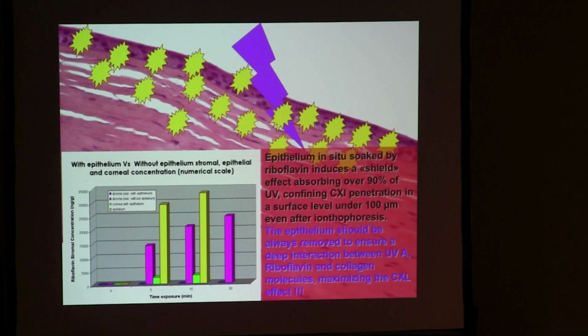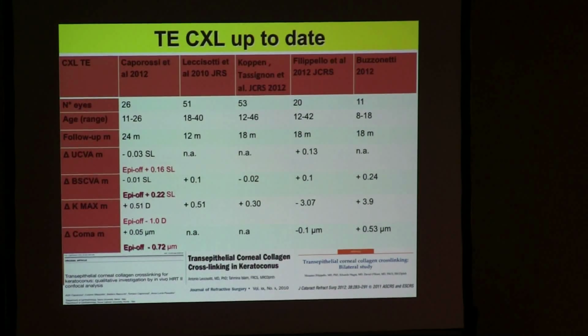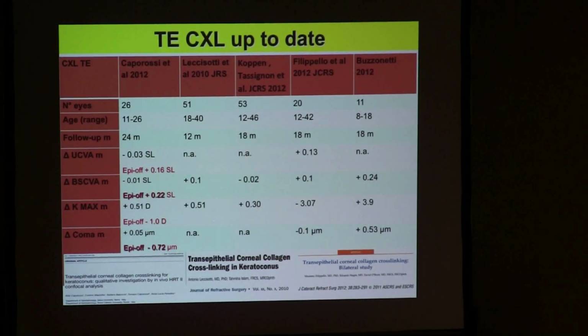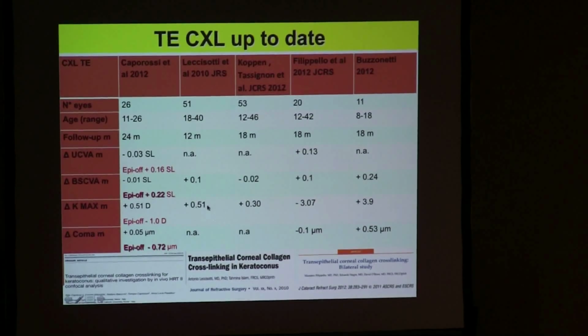And so we have a very superficial cross-link. We are safe, but we go very, very superficial. And this is not good also for surgical result. This is a review of the literature, and a part of the one work that is published by the creator of transepithelial collagen cross-linking, that is strangely very different from the other, but the other studies demonstrate how essentially the epi-on procedure does not affect anything.